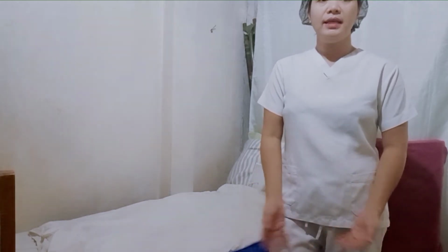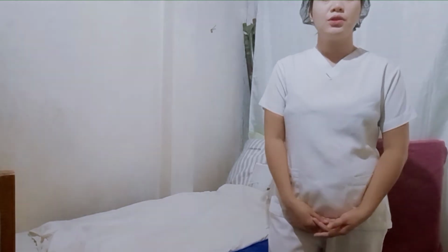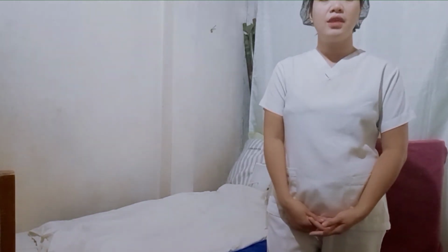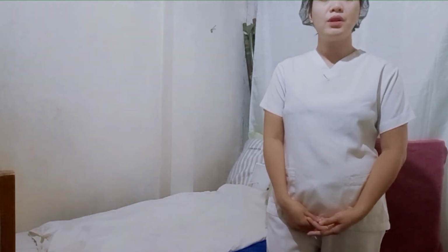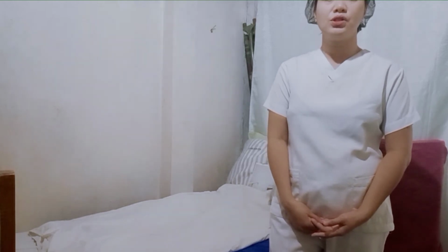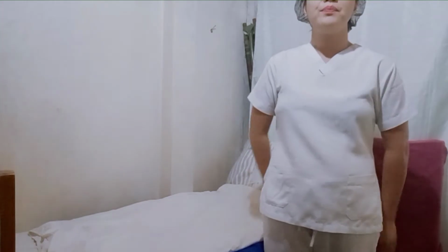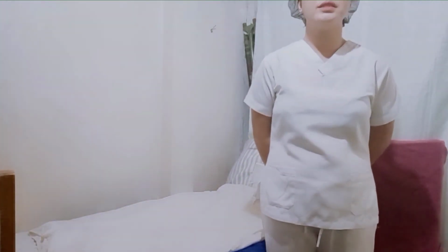Urinary catheterization is the introduction of a catheter tube through the urethra into the bladder for the purpose of withdrawing urine. Catheterization is considered the most common cause of nosocomial infection. So, whenever possible, catheterization should be avoided. When it is deemed necessary, it should be performed carefully and with strict aseptic technique.